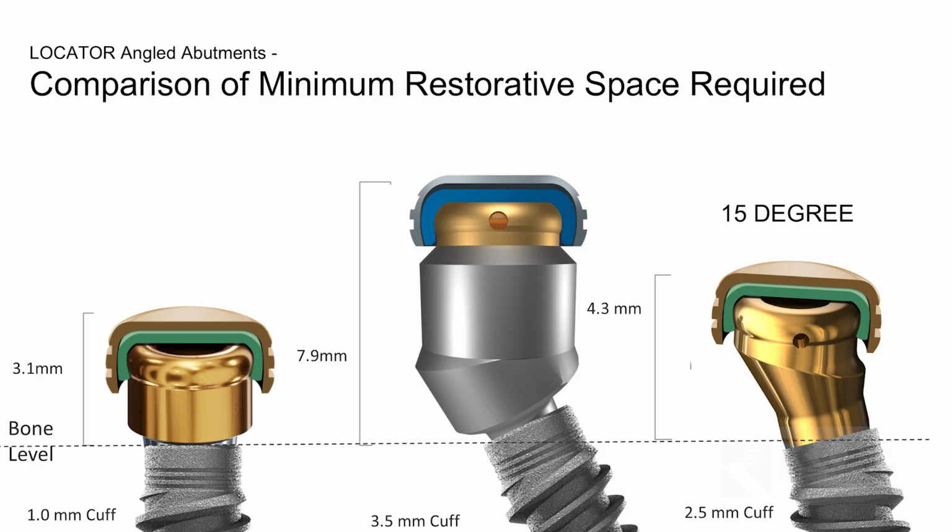And Colleen, how long has that been out for? Like 6 months or so or more? Yes. We introduced a few connections for the angled locator at the beginning of this year. We're continually adding additional connections. We'll have an additional 4 here before the end of the year.